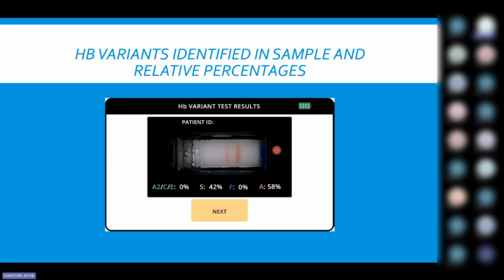Remember, we started with our band labeled here. Then the migration happens within the 8 minutes. Remember, this is the marker fluid. You can see it on the end. So this helps as an internal QC for each particular sample as they migrate.